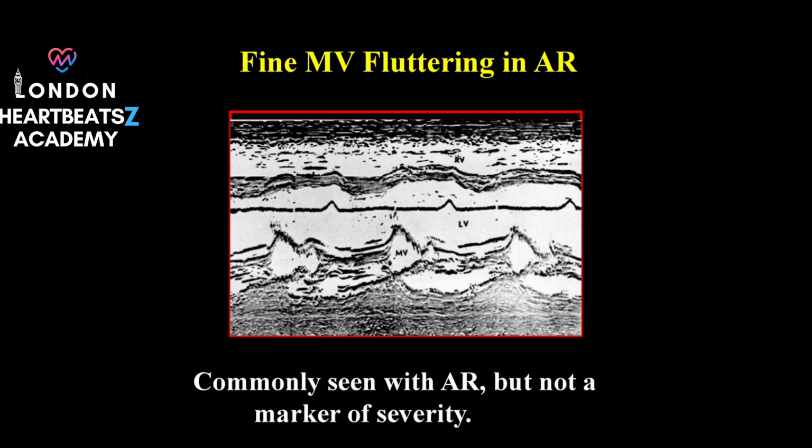M-mode can reveal a distinct flying W pattern on the pulmonic valve, which is the valve controlling blood flow from the right ventricle to the pulmonary artery. A flying W. That's an image that definitely sticks in your mind. What causes this unusual shape?